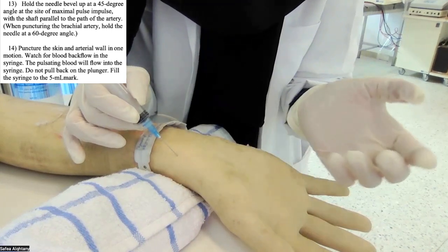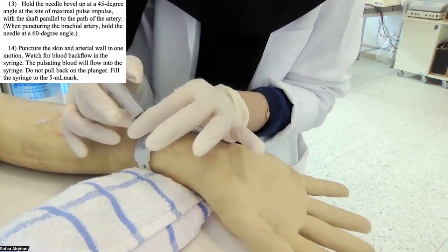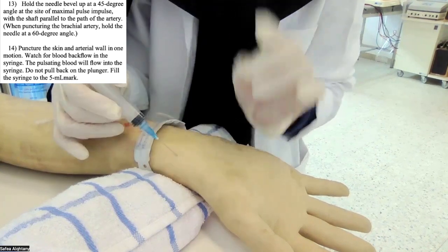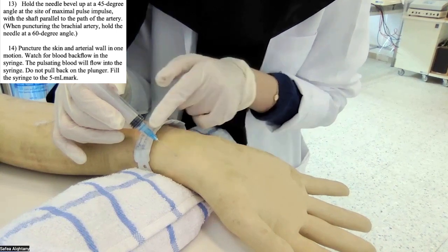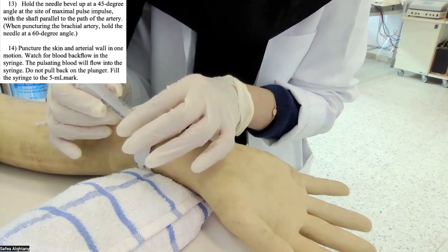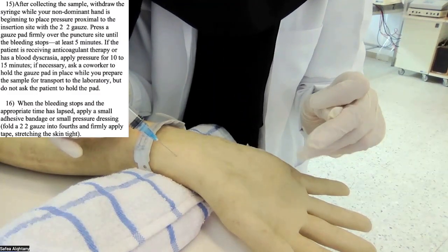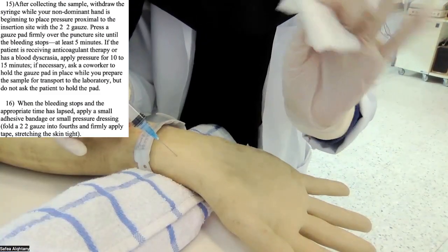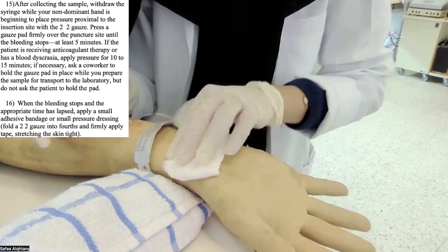طبعا في مميزات الارتري إنه هو يبدأ بضخ الدم وهو اللي يعبي لي السرنجة، يعني أنا ما أحتاج إني أسحب البلنجر. So don't pull back the plunger. Allow the blood or allow pulsating blood to fill into the syringe until we obtain the amount that we need, for example 5 ml. After the sample is obtained, I need to, with my non-dominant hand, يعني يد الثانية, I need to withdraw the syringe and apply pressure.